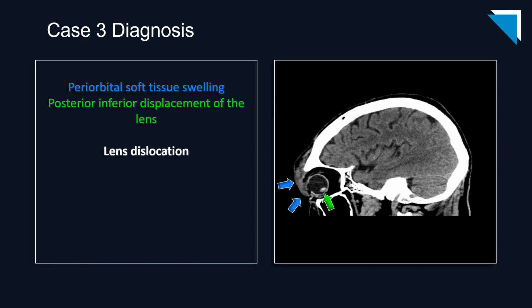For example, retinal detachments are a common finding on head CTs, and we frequently don't have secondary findings to draw our attention to the globes in those cases. So I would urge all of you to include the globes in your search pattern on all head CTs.